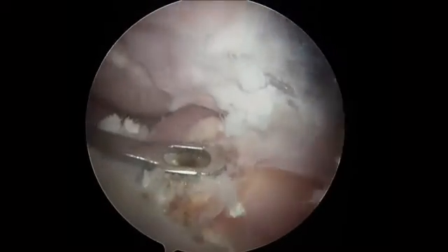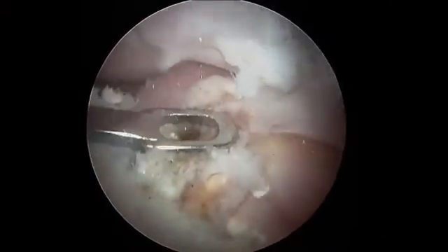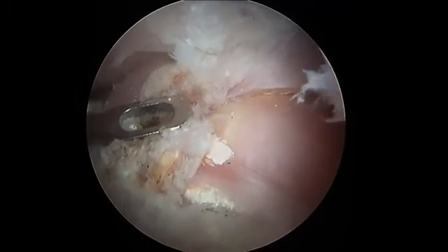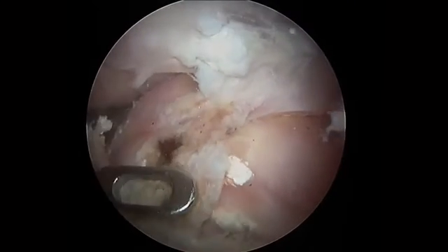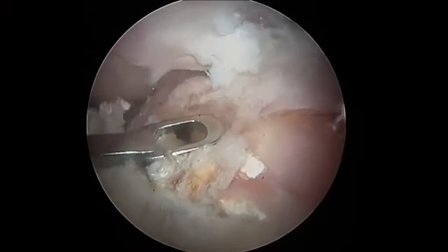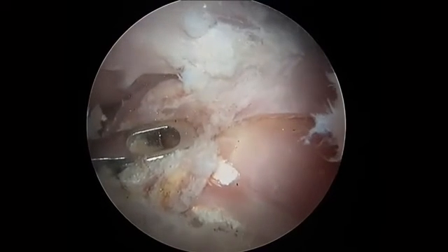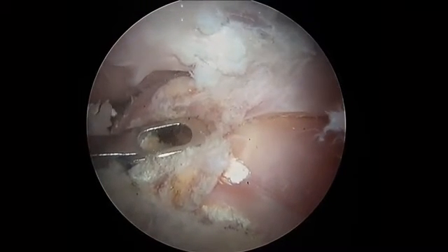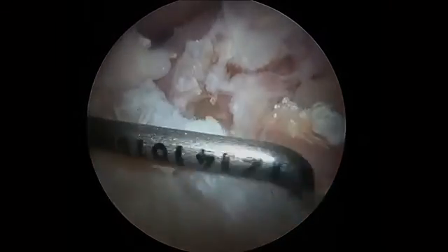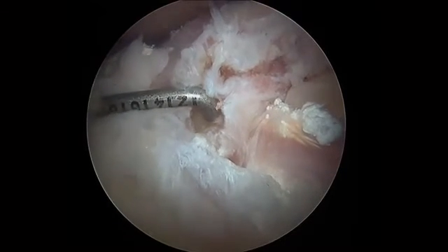Okay, now you get a more panoramic view. Why don't you drill? Panoramic view here. So there's the anterior horn of the lateral meniscus. There's my footprint. And a little bit on the medial aspect of the footprint, more towards the posterior aspect of the anterior horn of the lateral meniscus. So here's our tibial tunnel entering, again, on the back half of the lateral meniscus.